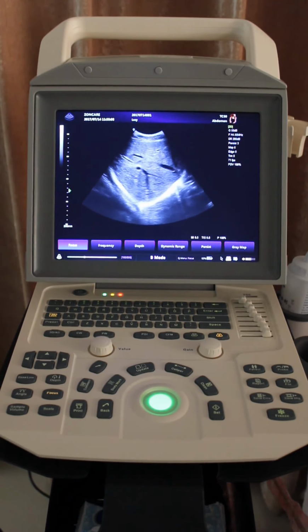So now, after having a very good B mode image and CFM mode image, we come to the final PW mode image, as we can see in the pictures. For the PW, as we mentioned previously, there are more parameters we need to adjust.